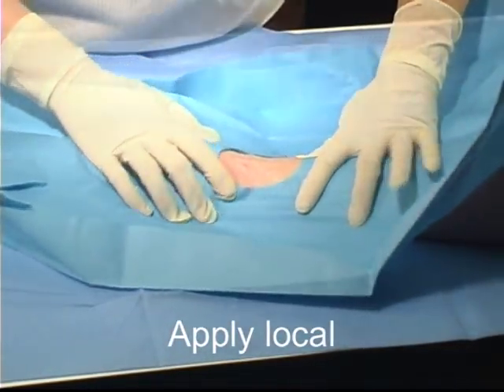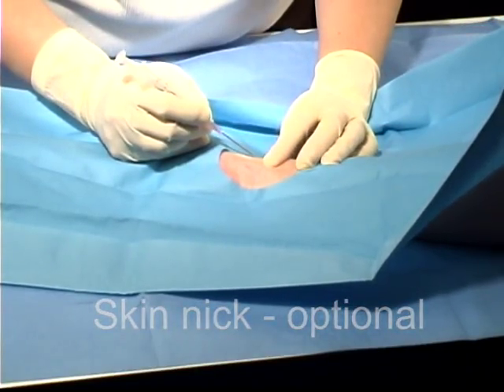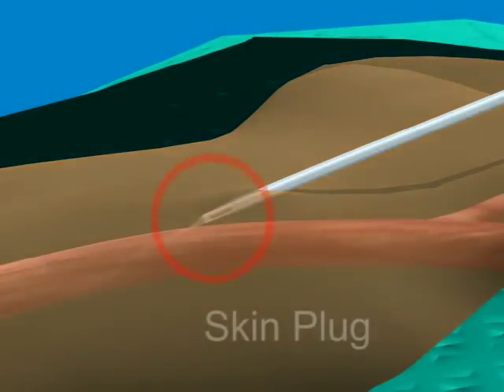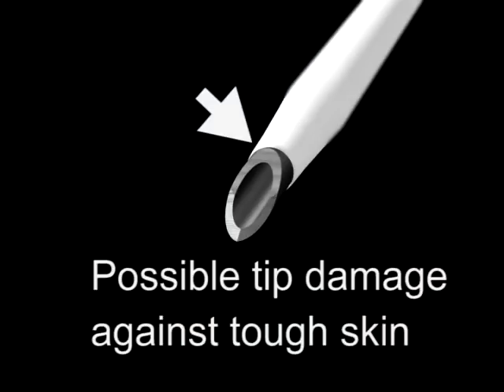Use local anesthetic as desired. Some clinicians perform a skin nick or dermatotomy, which is especially useful when the patient has tough skin — first, because it prevents a possible skin plug from blocking blood return through the needle, and second, because the tip of the catheter can be damaged if it encounters tough skin.